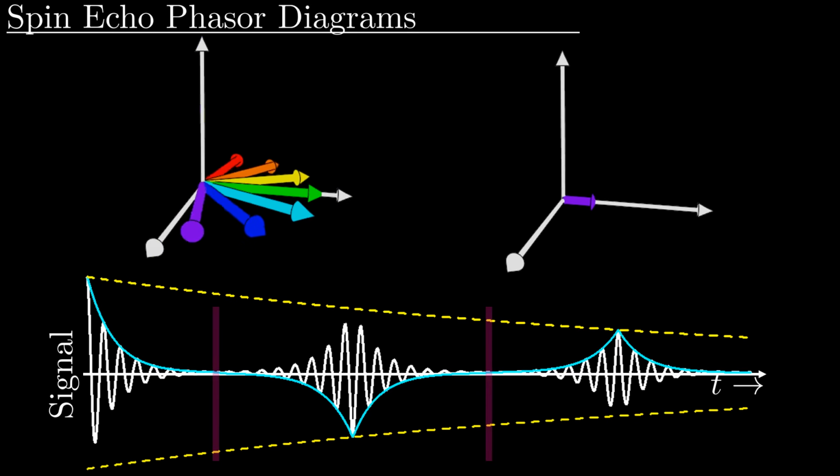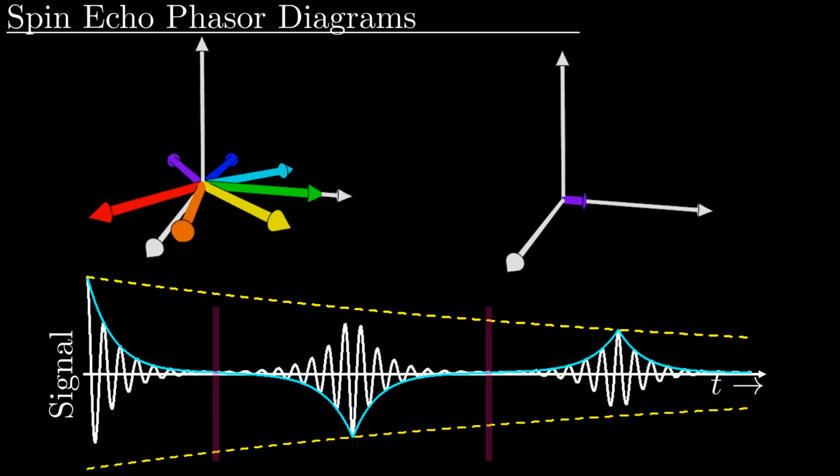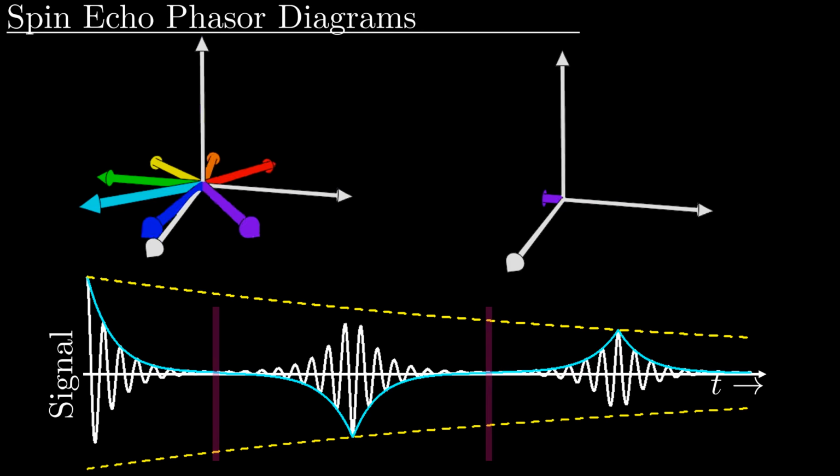Oh, so there you have it. The spin echo. While we focused on dephasing due to field inhomogeneity as being reversible by the spin echo, it will also reverse dephasing due to chemical shift and heteronuclear spin interactions. Spin echo sequences in MRI do have some drawbacks. They're often rather long sequences to conduct, and they do involve much more RF delivery compared with simpler gradient echo sequences, but we'll examine all those details at a later time.